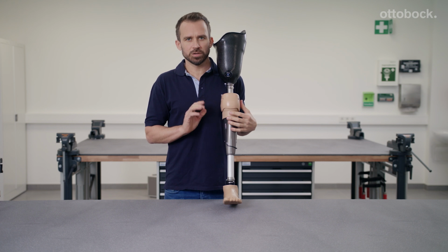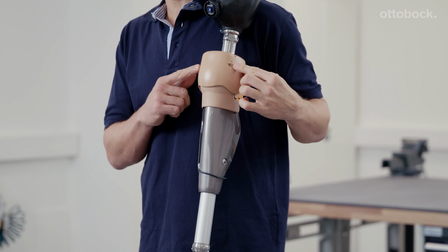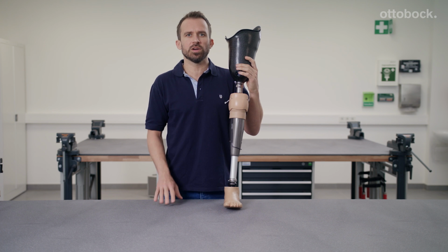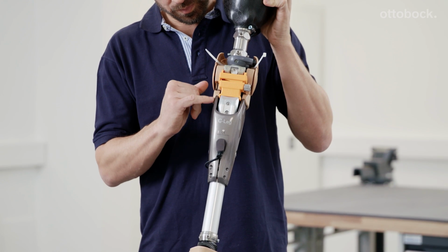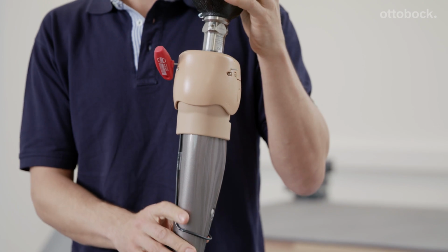Now install the functional knee part. Loosen any screws which have been pre-tightened. Once again, check that the metal bracket and plastic part are properly positioned and make sure that the functional knee part is fitted correctly on the frame of the knee joint. Secure the functional knee part again.